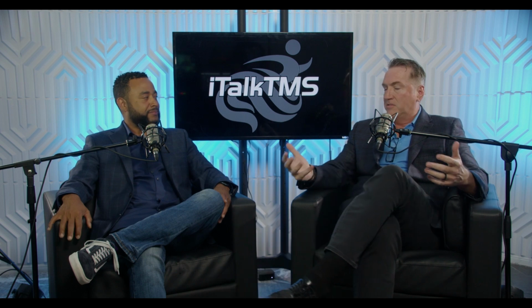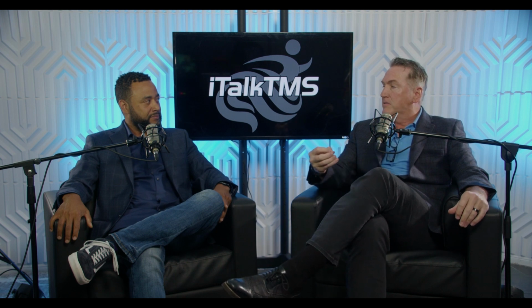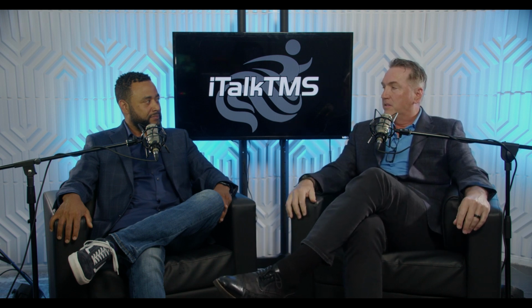So, doctor, what is TMS? So TMS therapy is transcranial magnetic stimulation. It's a process of giving a very small magnetic field through the skull to the cortex of the brain, allowing the brain to fire at different frequencies. The process is called neuromodulation. And the goal is to find ways to synchronize the brain. In our view, the personalized approach to this process that we call PRTMS allows us to deliver a very unique and uniform dose to various brain regions and having, we think, a better effect than standard TMS.